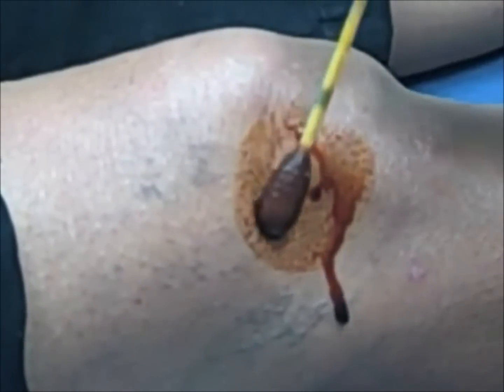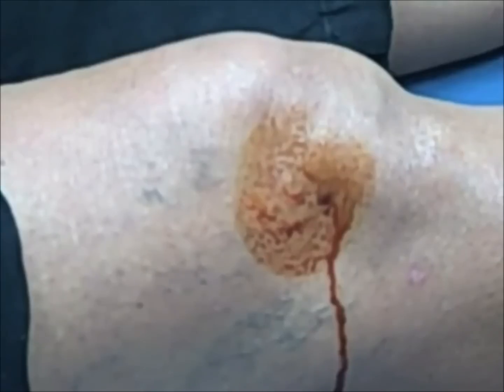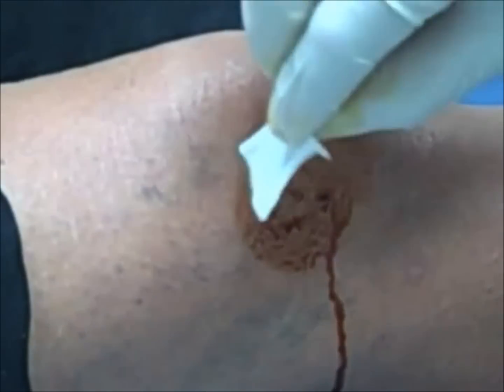Our next step will be to prep the skin using betadine and or alcohol solutions. Our medications that we're going to be using today will be 2 milliliters of a 1% sodium hyaluronate solution, and for our clinic we use Euflexa, but you can also use Synvisc, Hyalgan, or any other visco supplement.